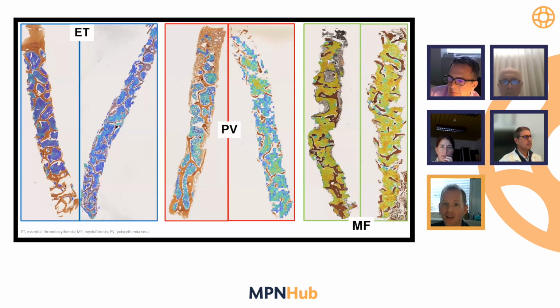What I think is interesting is in polycythemia vera particularly, we see in some patients very significant heterogeneity and actually quite severe focal fibrosis, which raises the question, when are these patients becoming post-PV MF? And I think we're really bad at spotting that morphologically. It's very easy to miss these early foci of fibrosis. My personal experience is that when I see these rendered heat maps of the marrows, I begin to report marrow samples differently. I begin to go after areas of interest that are flagged by this mapping approach.